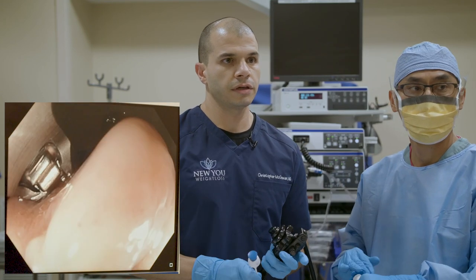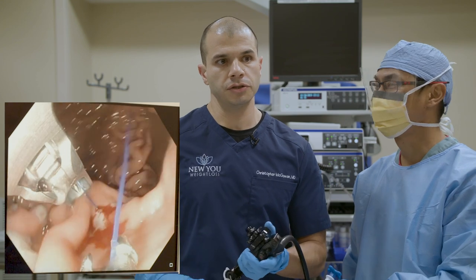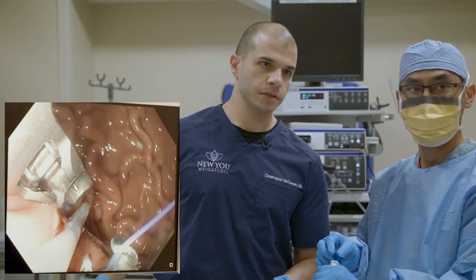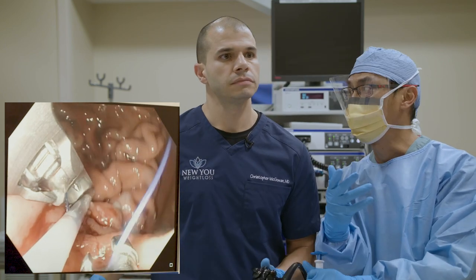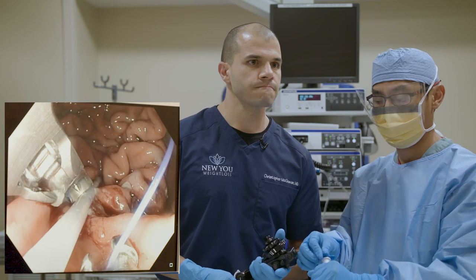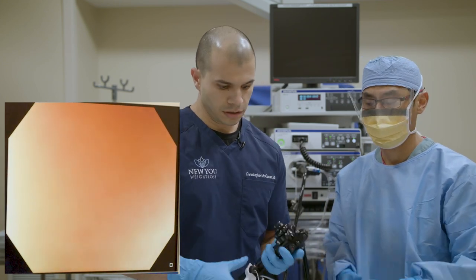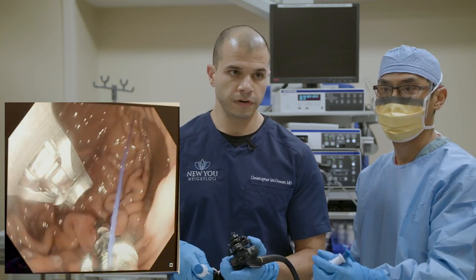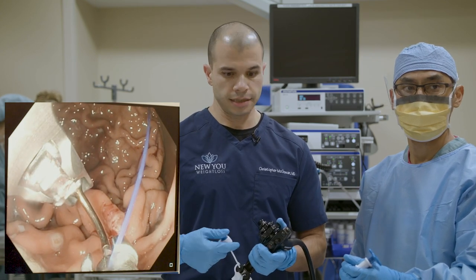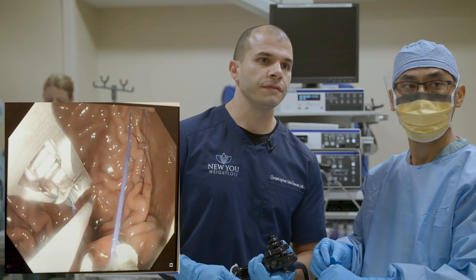Roche is counting every time he turns the helix device, whispering that in my ear so I know what he's doing — generally about three to four turns at the bottom, and maybe only two turns as we get towards the top where the stomach wall is thinner. We're always talking throughout to make sure we're achieving perfection. Now we're coming back up, completing the U-shape, and I'm satisfied that every single time I've passed this needle through so far, it's full thickness.